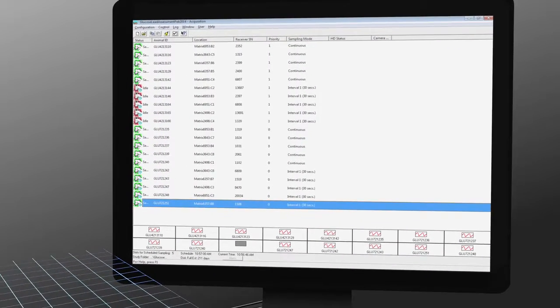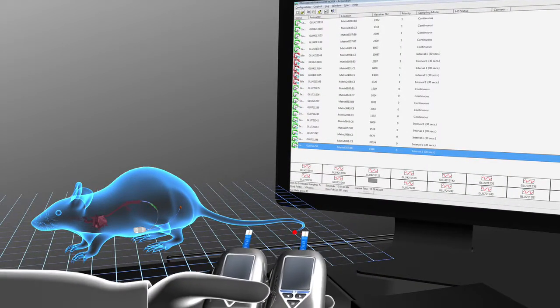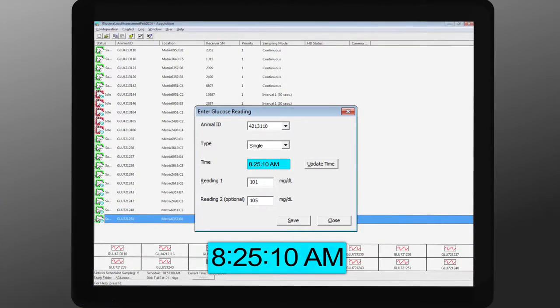To take a single-point calibration, draw duplicate blood samples while the animal has a steady blood glucose value. Record the values from the glucometer in DSI software or a spreadsheet.